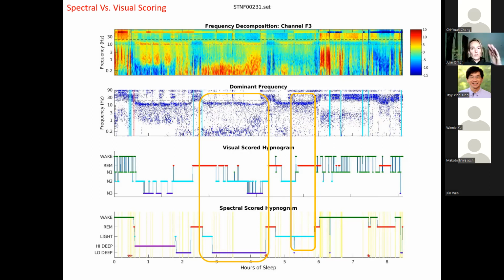While you cycle through them, it's just the percentage of either one changes from the first half to the second half. The high deep versus low deep, it is fairly common, if you're going to do a high deep only, for it to happen in that first cycle. But this is very person specific.